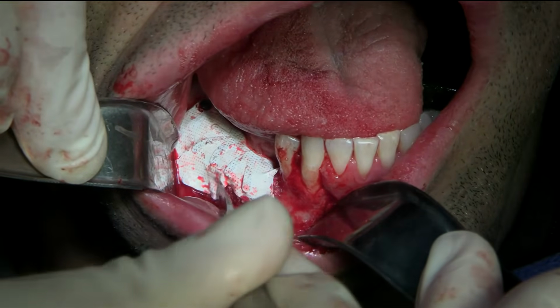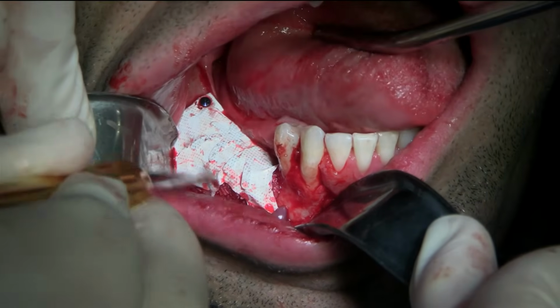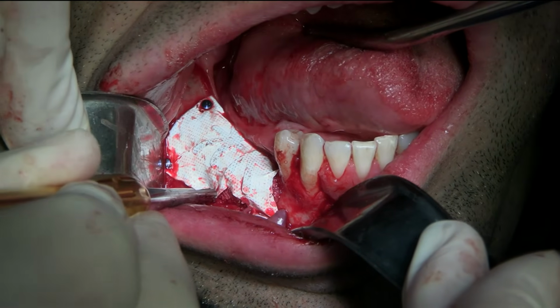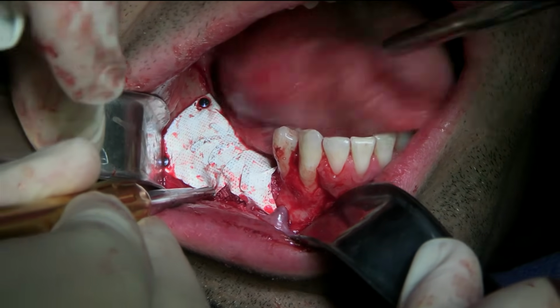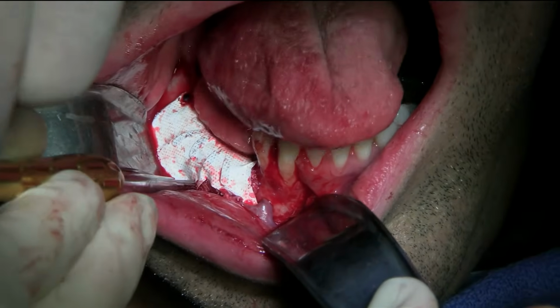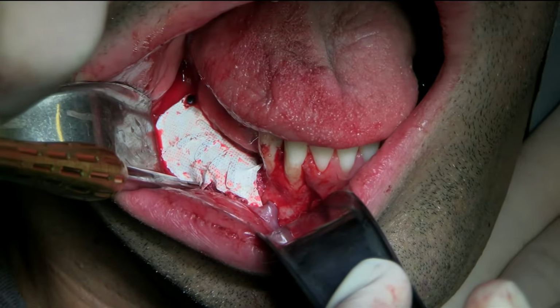You can open me a collagen. Can do a BioGuide, a small one, like a 13 by 25. But I need first here, because I need to tack. So come here. Retract this one, the back. Okay. Tapping.